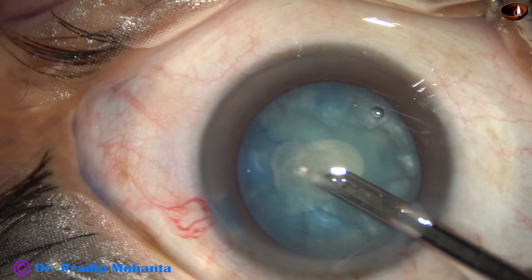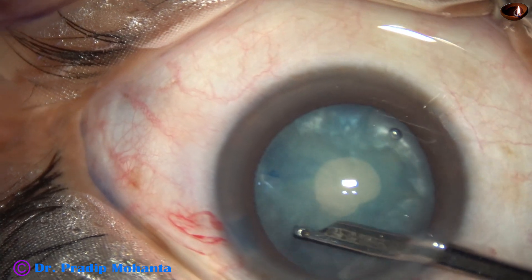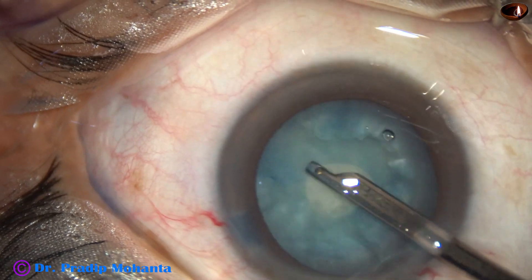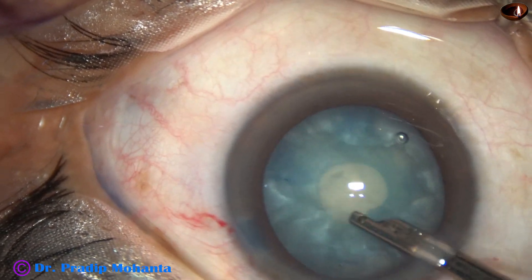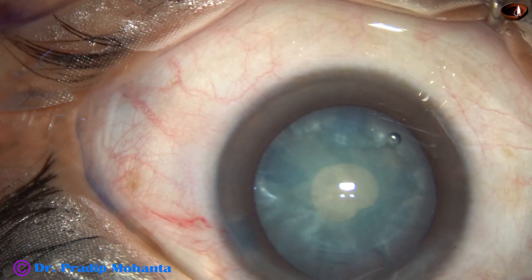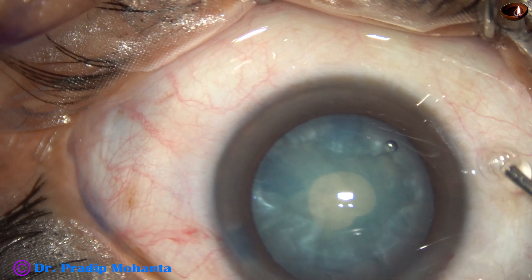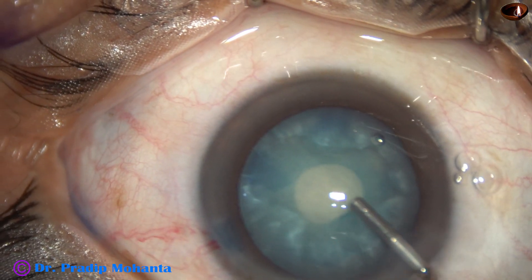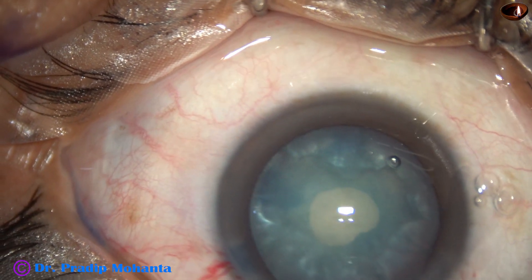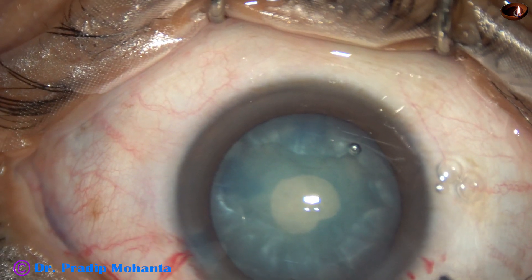In this case, the difference in keratometry reading is about 0.6 diopters. So I don't want to induce more astigmatism in this case. After reducing the intralenticular pressure, visco — that is 2% HPMC — is injected again.